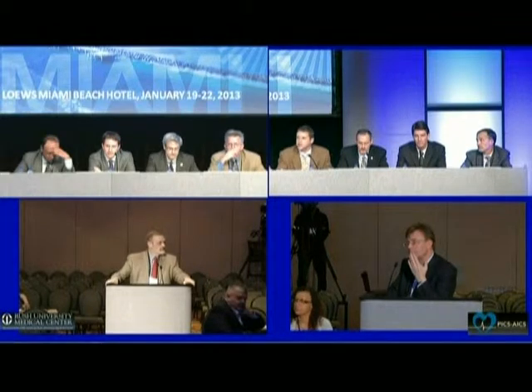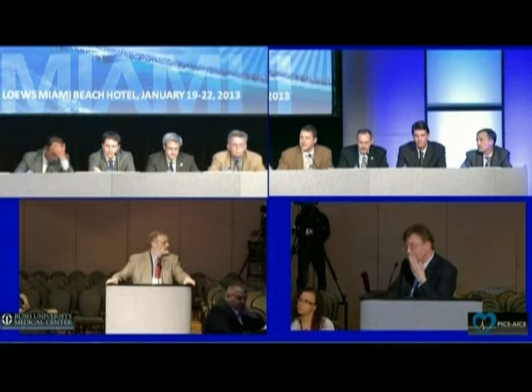I actually was really interested in the application of bringing 3D echo online into the fluoroscopic images, because I thought where you were going to go, Neil, is your keen observation that really what we show here are pulmonary arteries and vascular structures. We're not showing cardiac structures. And we have tried looking at VSD and ASD and all of these things with 3D RA, and it's clearly, to me, trying to fit a square peg in a round hole. It's the wrong tool.